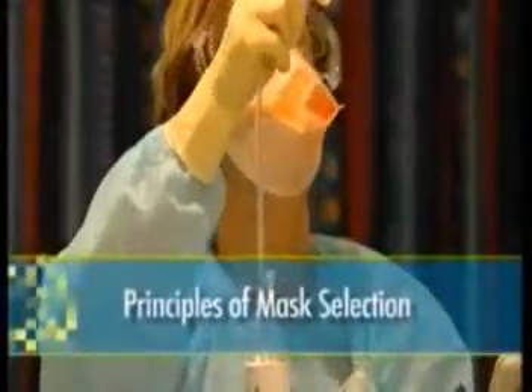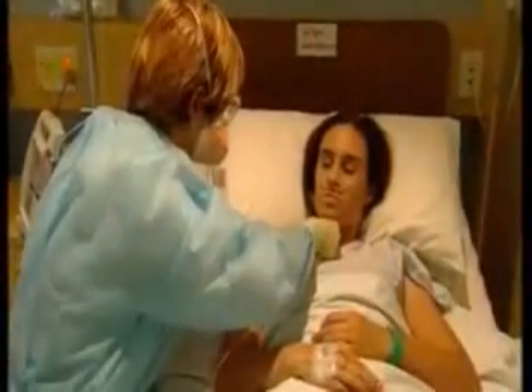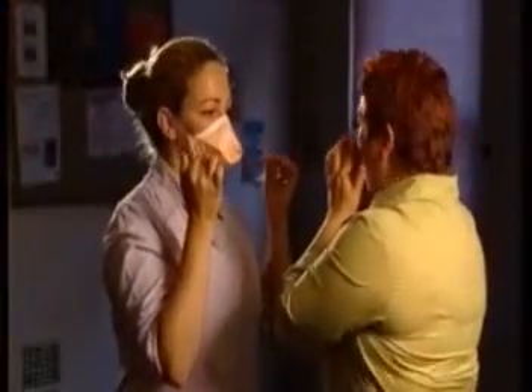In the event of an influenza pandemic, healthcare and other ancillary workers may be required to wear disposable high filtration masks, such as P2 or N95 respirators. To ensure maximum safety and protection of the user, these masks must be selected to suit the individual's facial structure.